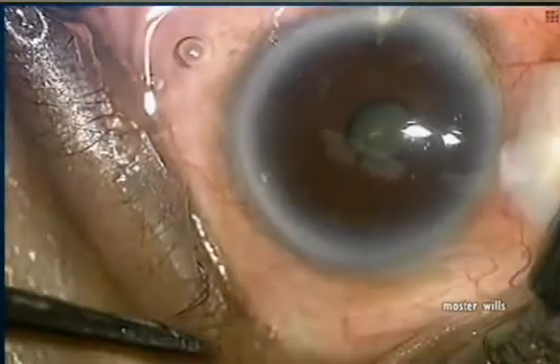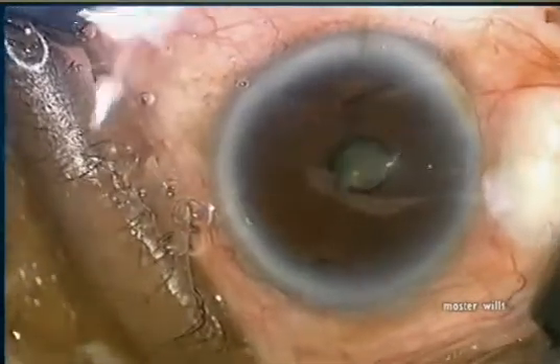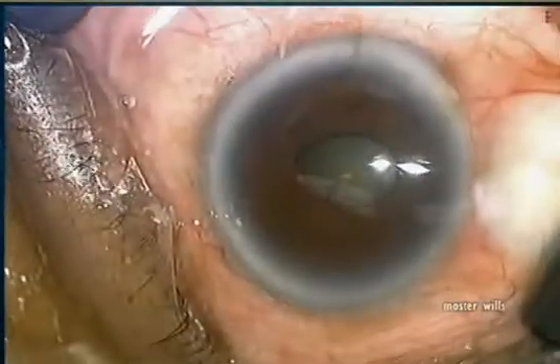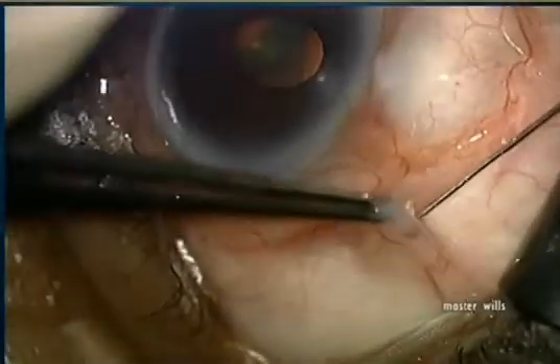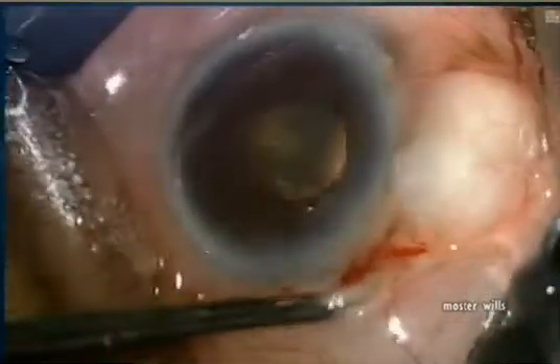This is the blitz anesthesia technique. We first make a paracentesis followed by 1% non-preserved lidocaine — notice how the pupil dilates immediately. We then switch to a 30 gauge needle on the same 1% non-preserved lidocaine to blow up the conjunctiva.